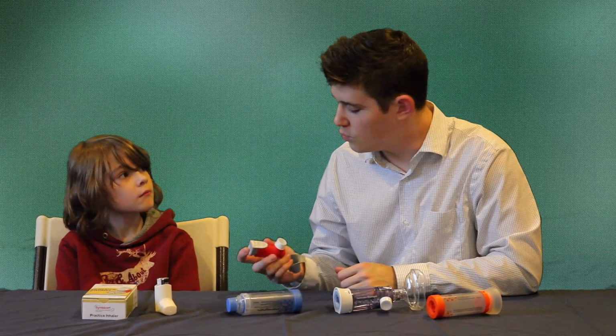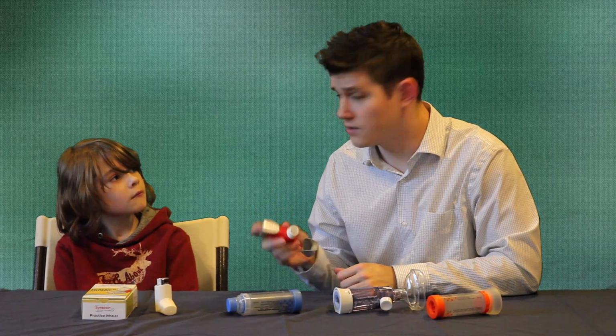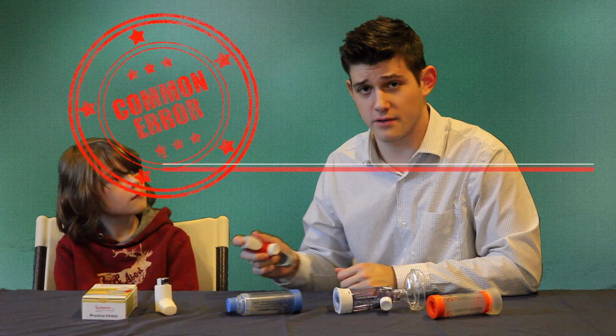Now that it's primed, we need to shake up all the medicine inside. So we need to shake it for 5 seconds. Always for 5 seconds.